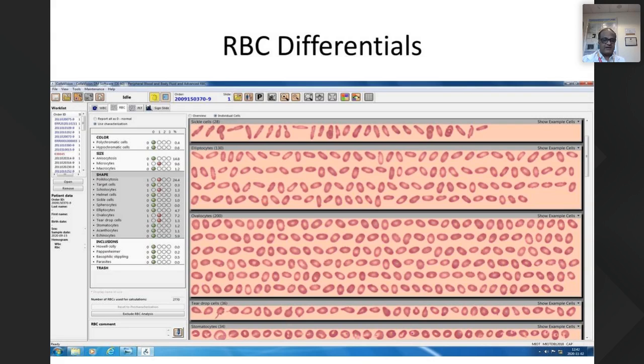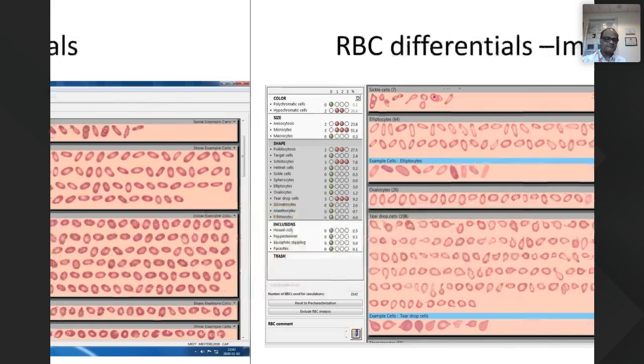During the COVID epidemic, or the pandemic, what we can call it, when we were having peripheral smears from COVID patients, we used to put the FRBC functionality on the automated hematology analyzer, as well as the automated differential count, to know the percentage of FRBC. We also went for RBC differential from the CellaVision to understand, do we see any schistocytes here? More than 3% becomes critically important, and we have to inform the clinician that I am seeing 3% fragmented RBCs, correlate with the LDH to understand whether this patient is having hemolysis.